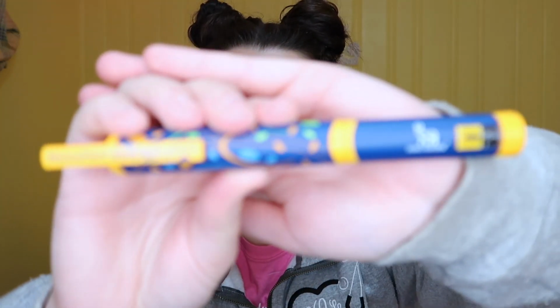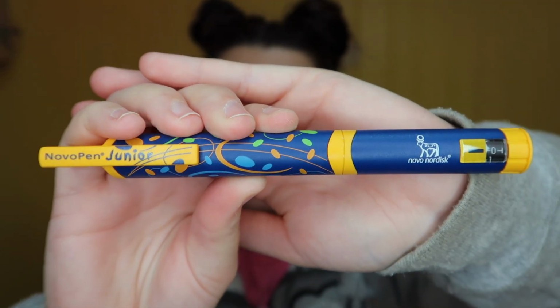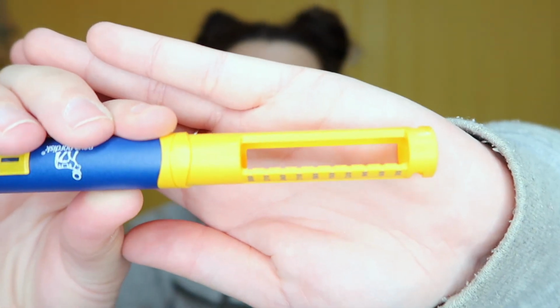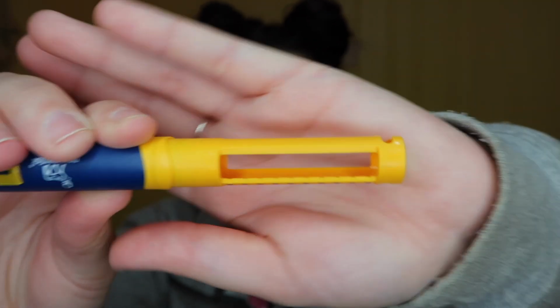This was the junior one. So it was super colorful, and it came in yellow and green. And this is a really heavy, metal pen. So you would take the cap off, and you would have this little area right here, which on the disposable pens the insulin would be.